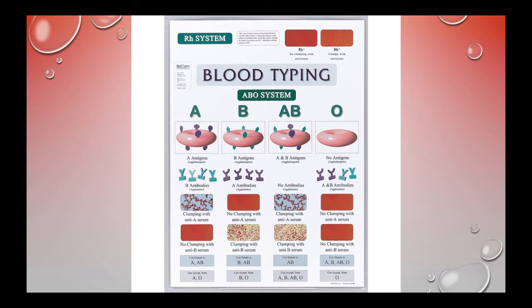They cause, and I shouldn't say clotting, but clumping, because I really want to establish the distinction between clotting and agglutination. Clotting has to do with your platelets and clotting factors. Very different than agglutination. Agglutination is where you have antibodies binding to the antigens on the surface of the erythrocytes and causing clumping.